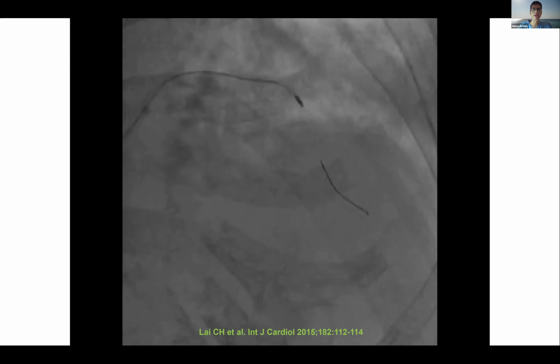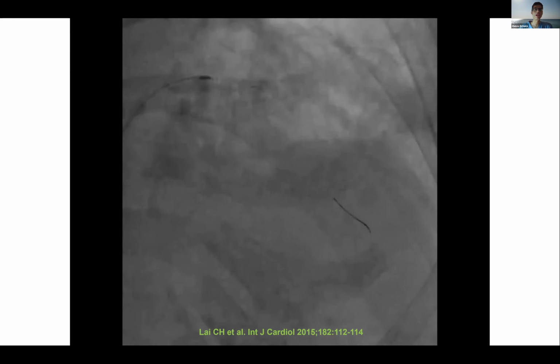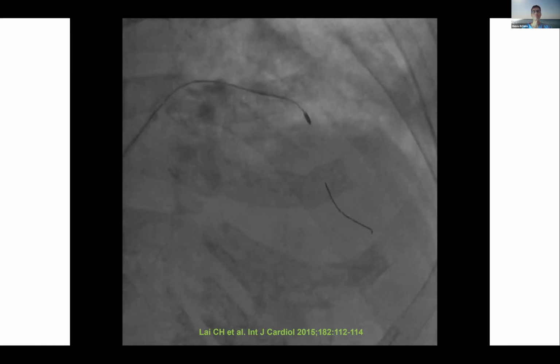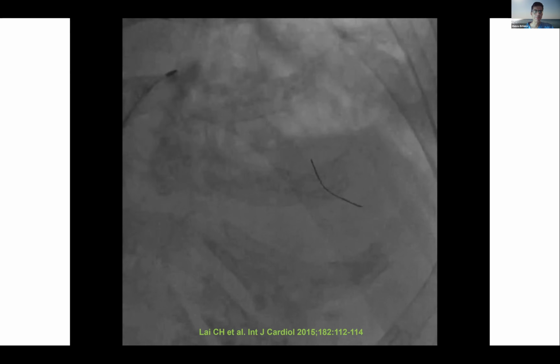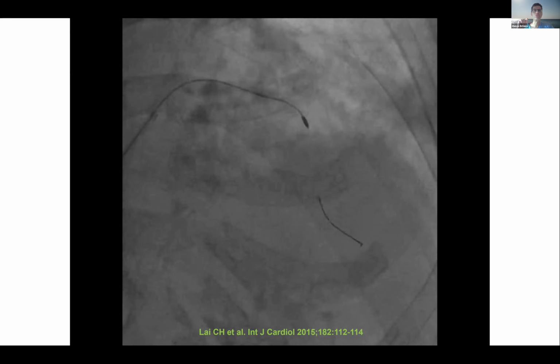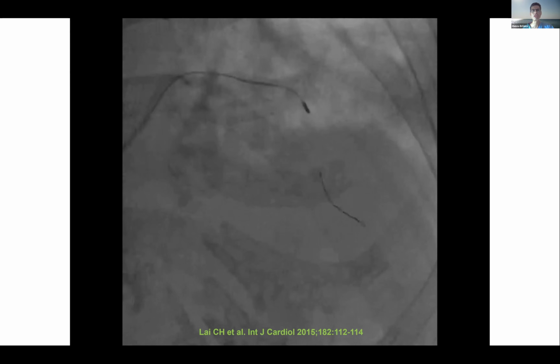And I guess there are many things here, as you said, right? With orbital atherectomy, you just go nice and slow and advance 1 millimeter a second, and that's perfectly fine. But with rotational, you want to do this pecking motion. You hit a little bit, you come back, you go back and forth. You really don't want to push it very hard, especially if it's stuck in the same place, for many reasons.